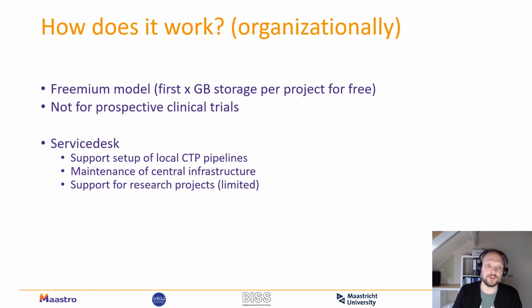One part of it is that before a research project really starts to upload all the images, we will ask the study, for example, to download one of the patient's or sample images again and run it through their intended analysis environment, so that we definitely know that for hospital A, B, or C, the pipeline of getting the data locally, de-identifying it locally, sending it to the central location, storing it centrally, downloading it from the central location, and then using it in practice actually works.